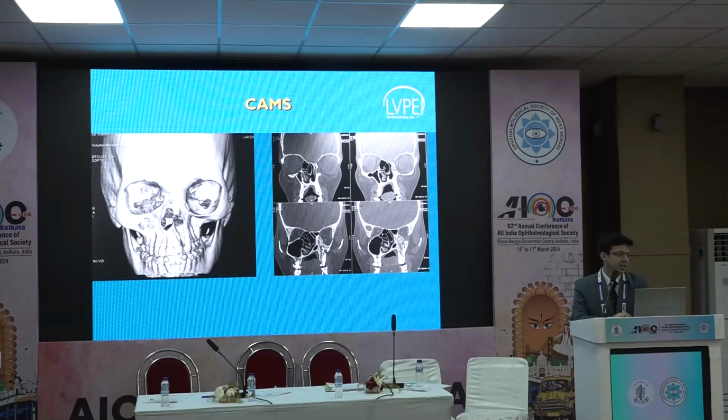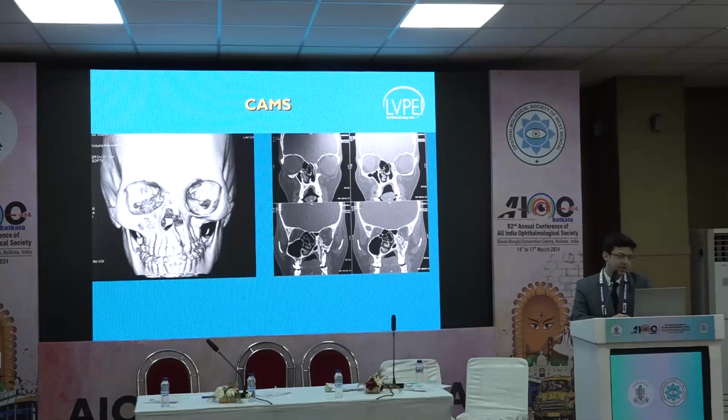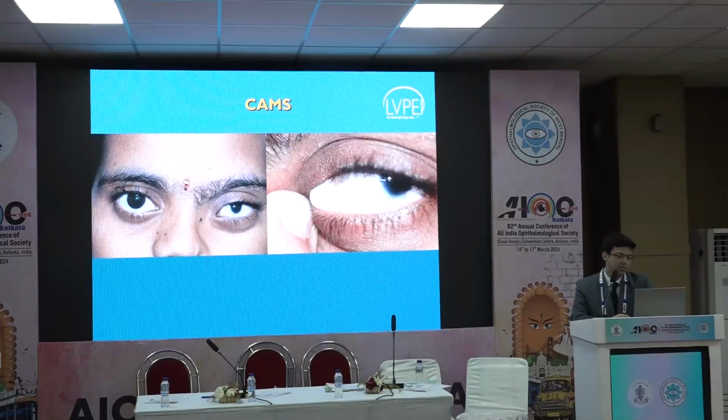So when we see the CT scan of this patient, you can actually see on the right side the nasal structures, the sinuses, but on the left side there's no maxillary sinus, there are no nasal structures seen. So this is a congenital arrhinia. So now this patient we saw in the earlier image is epiphora positive. She has a nasolacrimal duct obstruction, wants correction. So how do we go about it?